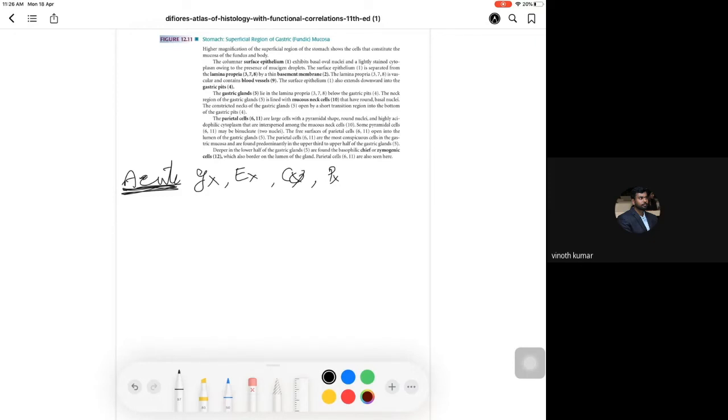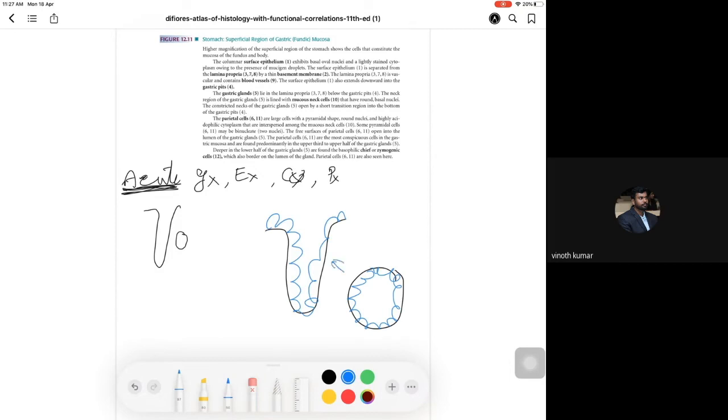The acute gastritis, you saw the glands, these are all the crypt epithelium, and when the glands are cut tangentially, they will be like that. I will draw one of the glands. What is this area in between the glands, Abhijit? Sir, lamina propria, sir. Super. And what is this area, red color, which I am drawing? Muscularis mucosa, sir.